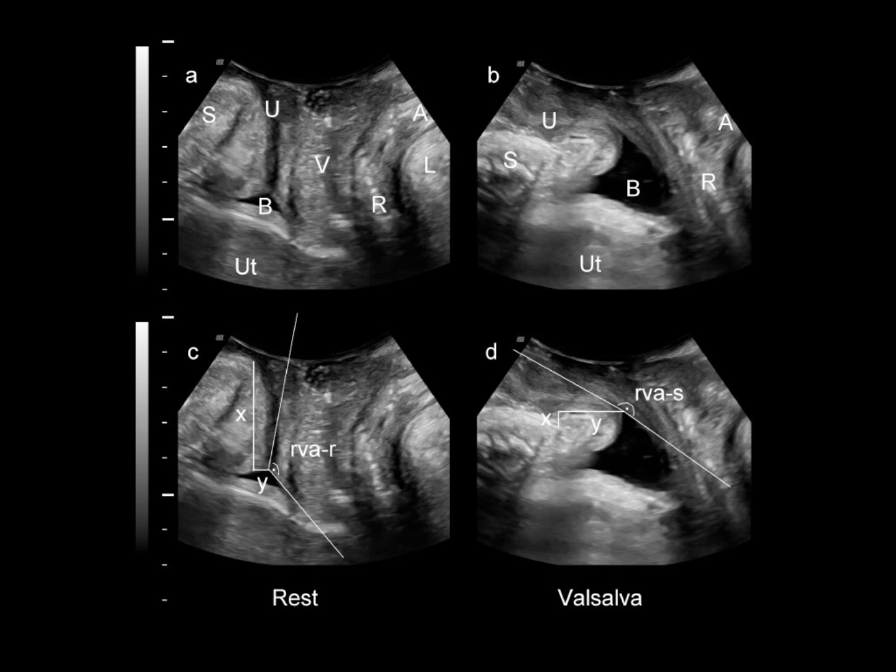Now that's not quite so normal, and in fact that image illustrates the typical anatomy of stress incontinence. Or you could even say the typical anatomy of urodynamic stress incontinence. So at rest, there's the symphysis pubis, the urethra from the external meatus to the internal meatus. The dark stripe is the longitudinal smooth muscle and the mucosa. The bright stripes are the urethral rhabdosphincter. That's at rest, that's on Valsalva.